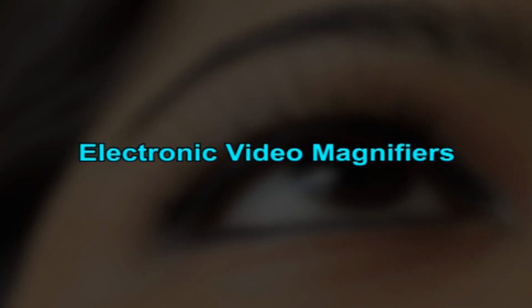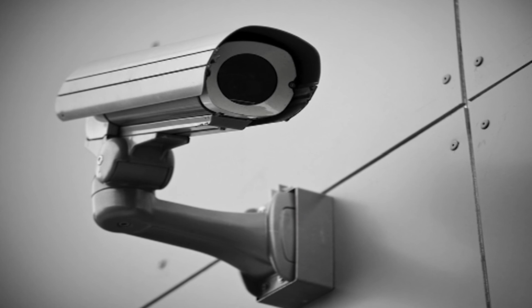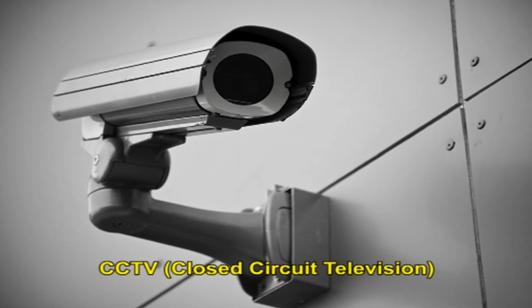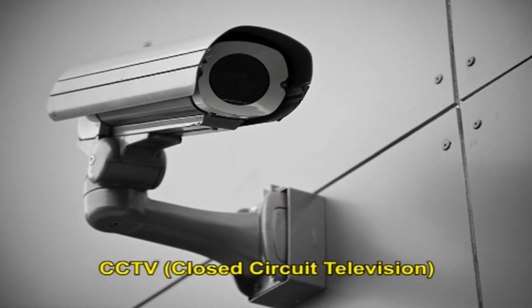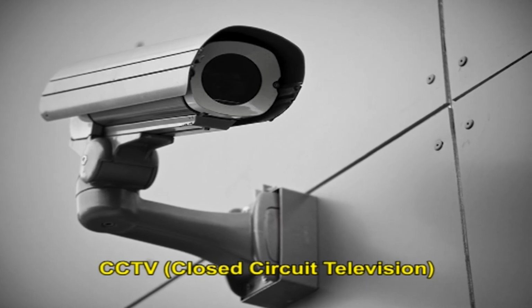Electronic video magnifiers. Electronic video magnifiers, also called CCTV, closed circuit television, are among the most universally useful tools for someone who struggles with vision. An electronic video magnifier is equipment for reading that consists of a stand mounted or handheld video camera that displays a magnified image on a video monitor, television screen or computer monitor.